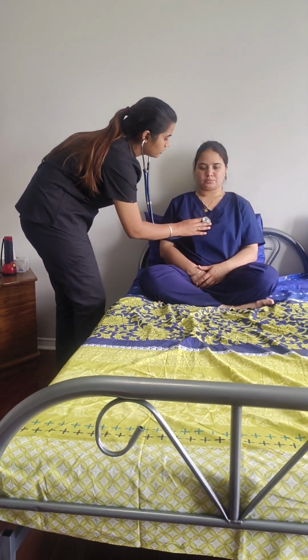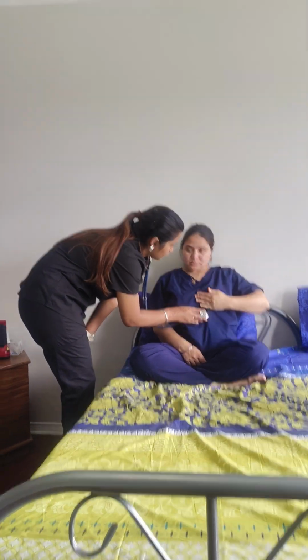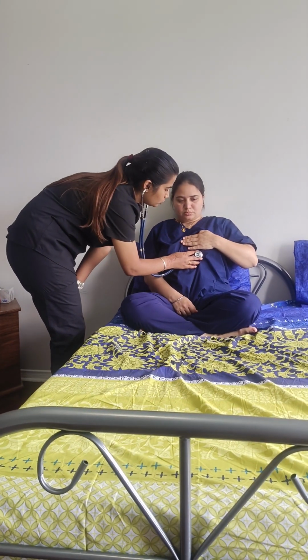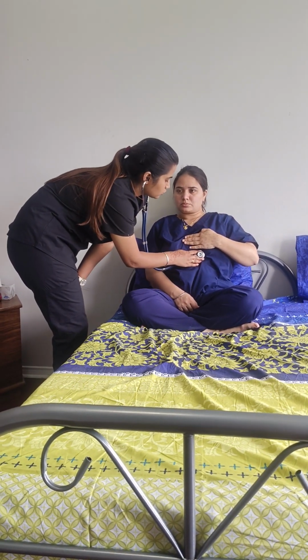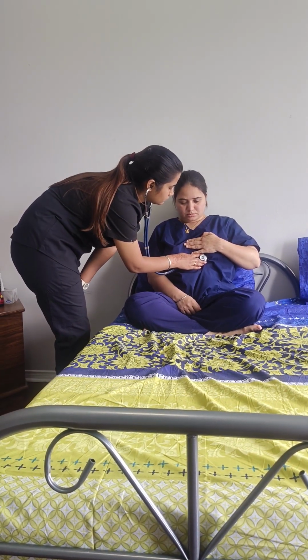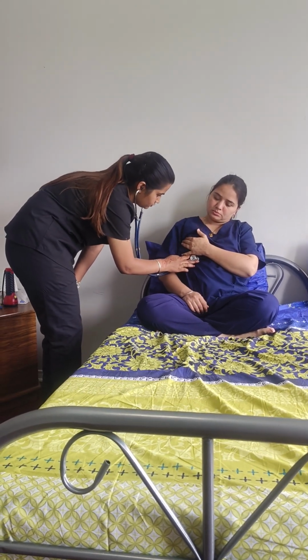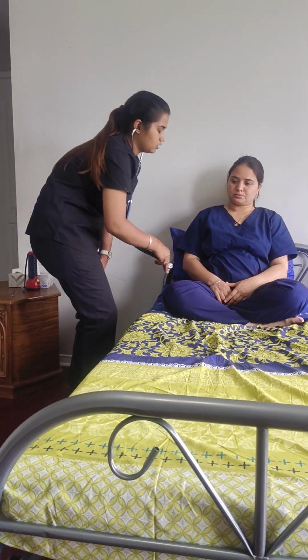Now I am going to check for the lower lobe or the base of the lung, and I am going to put my stethoscope at the sixth intercostal space. Similarly at the right side. Thank you.